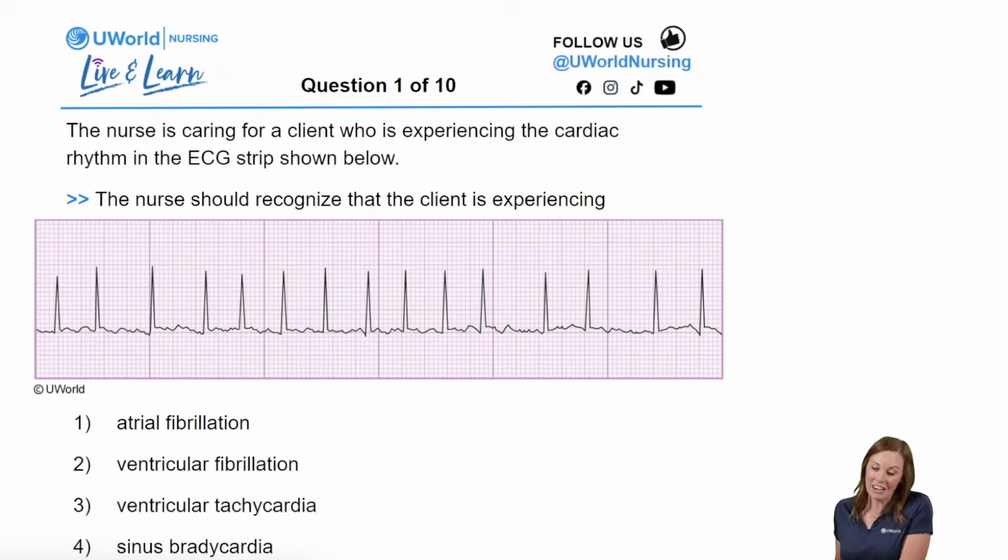I'm seeing a ton of great answers come in. The chat is flying today. We love to see that. Our 30 seconds has probably passed, but I'll give you all about 5 more seconds as people are trickling in. As a reminder, we're doing ECG questions today. We have 10 and we are on number 1. Keep track of these as we go so you can let us know at the end how you did.